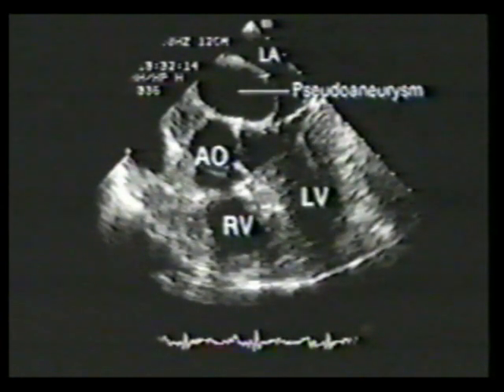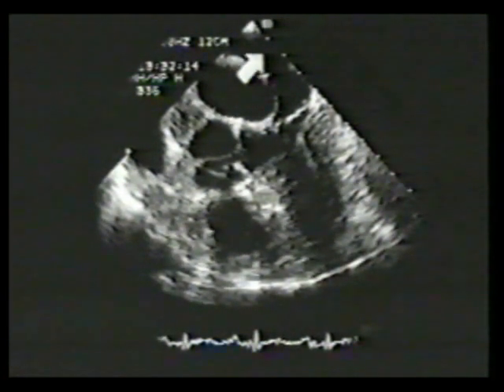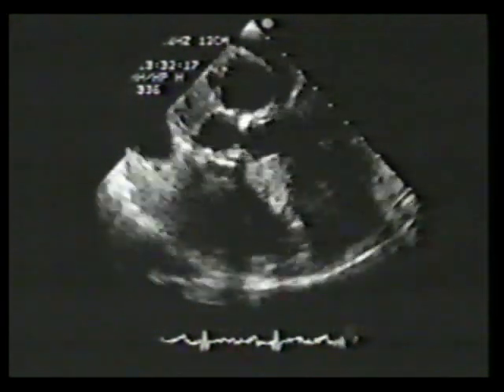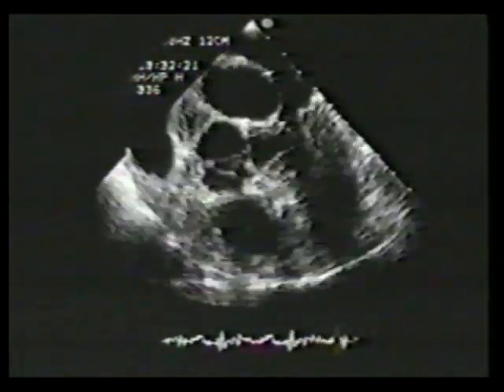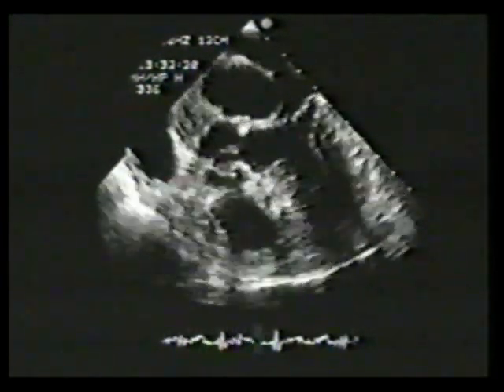Transesophageal echocardiography in this 78-year-old male identified this cavity adjacent to the aorta. This is a pseudoaneurysm which contains thrombus. There is significant risk of full aortic rupture through the adventitia which lines the false aneurysm. The image has been expanded. This is the false aneurysm, aortic root, and LVOT. In addition to the aortic regurgitation, color flow imaging demonstrates the communication between the aorta and the pseudoaneurysm.